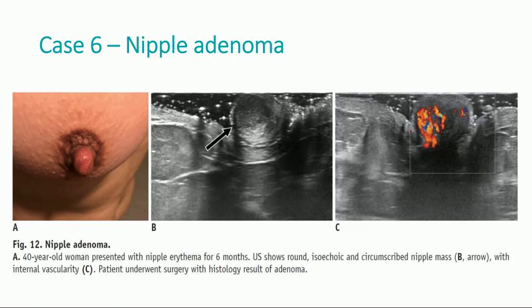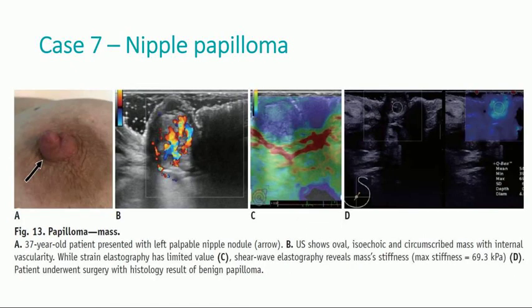Another rare nipple tumor: nipple adenoma, observed in a patient that presented with nipple erythema for six months. The ultrasound shows a round, isoechoic and circumscribed mass with internal vascularity. All of the above patients underwent surgery with histology results available. Nipple papilloma presented as a mass in a patient with a left palpable nipple nodule. The ultrasound shows an oval, isoechoic and circumscribed mass with internal vascularity. While strain elastography has limited value, shear wave elastography reveals the mass stiffness.